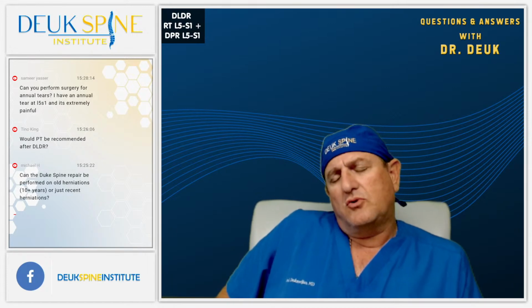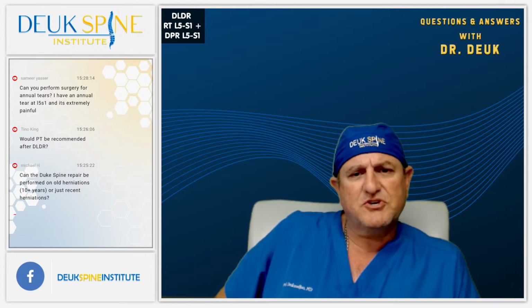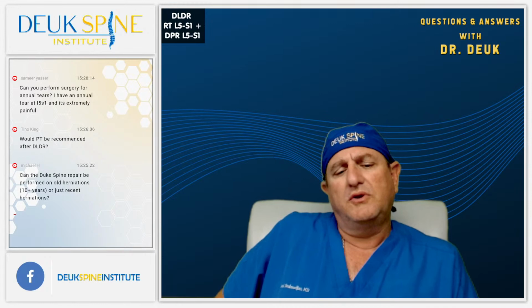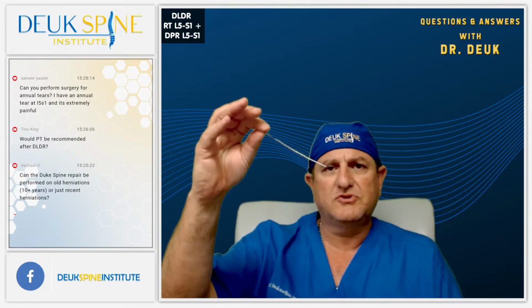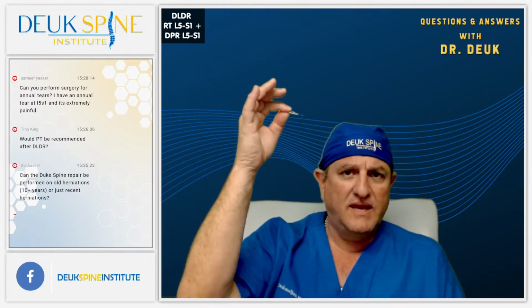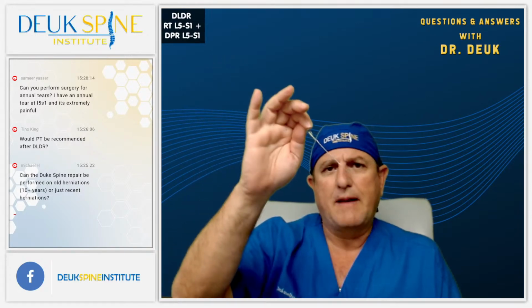Hey Matt, great question. So 2 questions. Are you ever worried about hitting a nerve when you're putting the endoscope in? Absolutely not. And number 2, are you worried about hitting a nerve with the laser? Absolutely not. And here's why. If you notice, the first thing I do at the beginning of surgery is I place a needle. That is when hitting the nerve could happen, just during that first step.